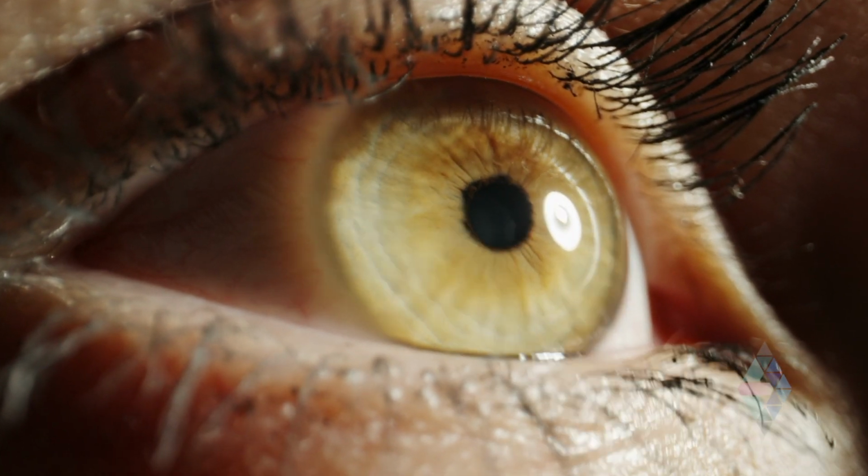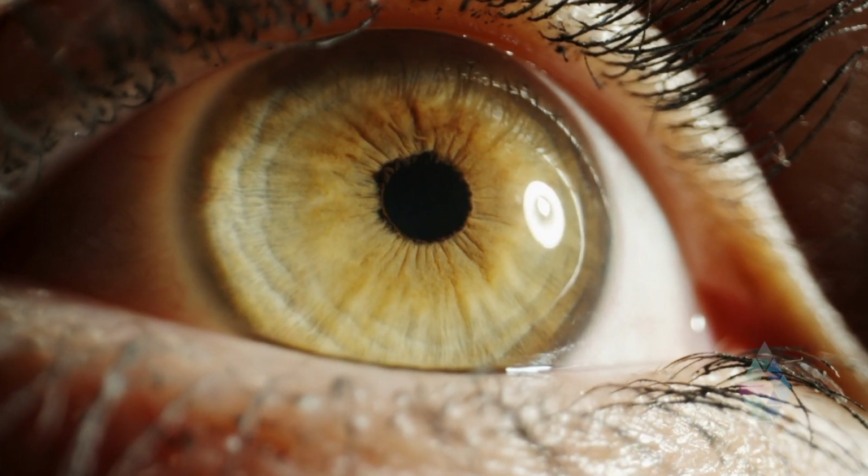For us here, we basically use them for patients who either have significantly high levels of nearsightedness beyond what LASIK can correct, or folks that may have some abnormalities in the shape of their corneas, whereby trying to change the shape with the laser may not be as predictable. And we're happy to offer it here at Magruder Laser Vision.